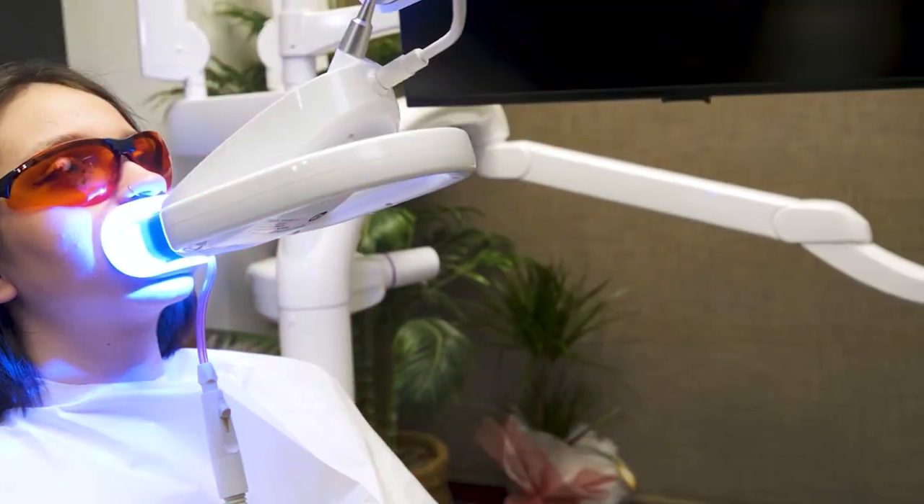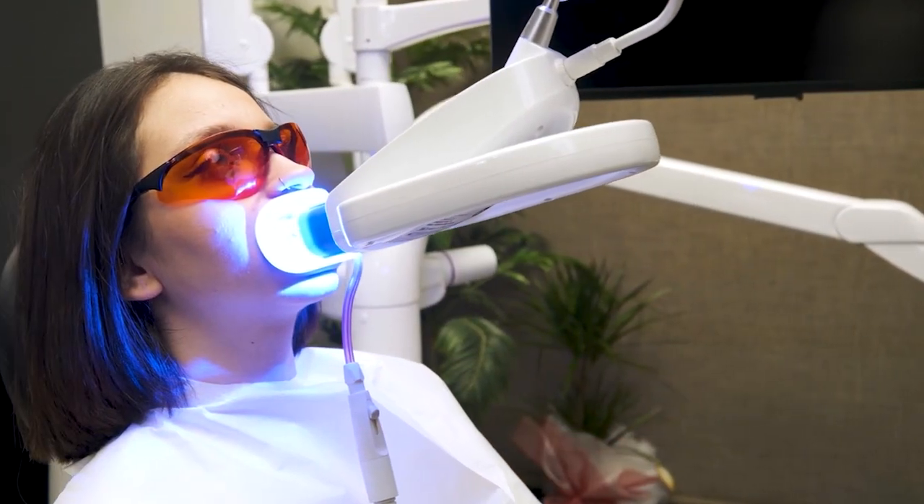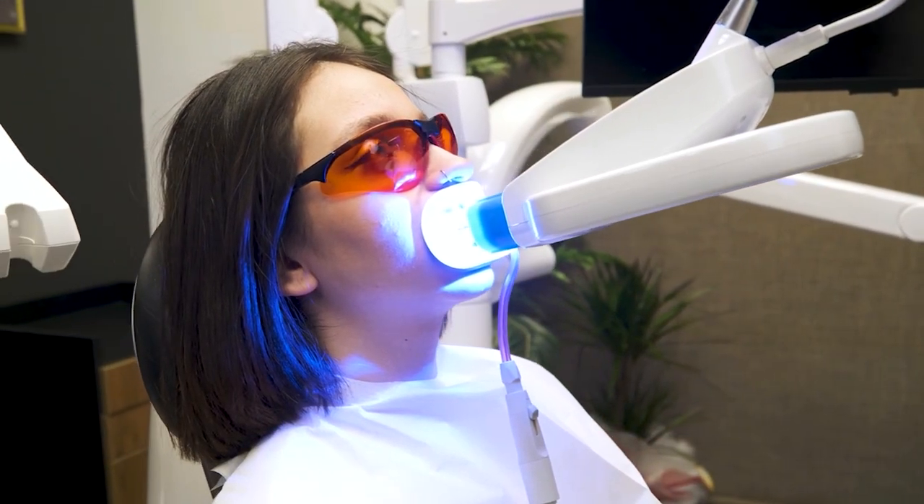It's also going to be assisted by a light. We use the Zoom whitening system here at the office, where we do three sessions of 20 minutes each. Depending on patient comfort, we always make sure that the patient is comfortable with no signs of sensitivity and no discomfort.